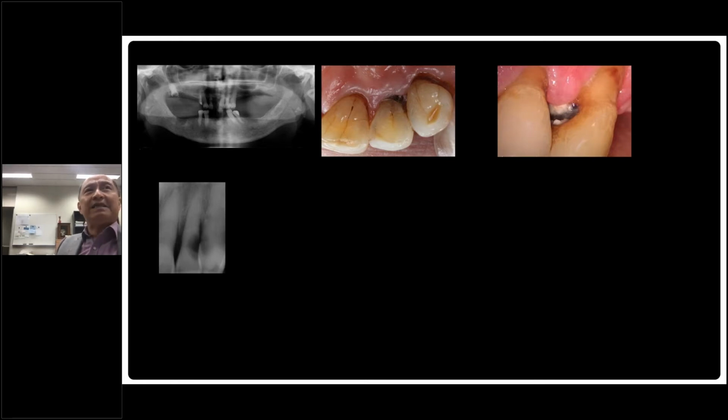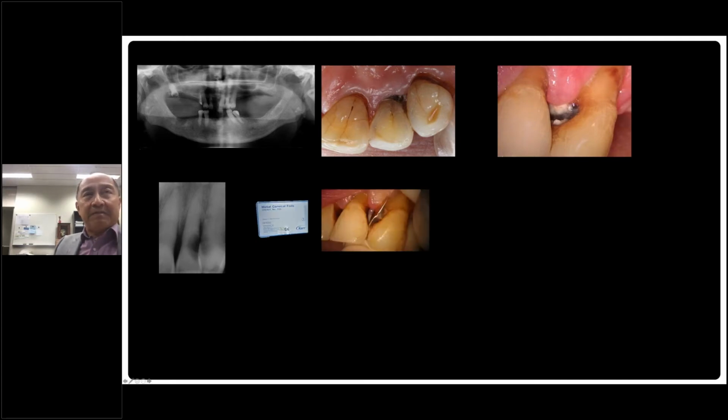When you look at this lesion on the central and on the canine, I would look at the depth of it, how far it has gone under the gingiva. Moisture control would be very difficult or unachievable. Acid etch and maintaining a dry field would be impossible. So in this case, I would say the material of choice of all we have must be a glass ionomer cement. To use glass ionomer cement, it's very important that you don't freehand build it.